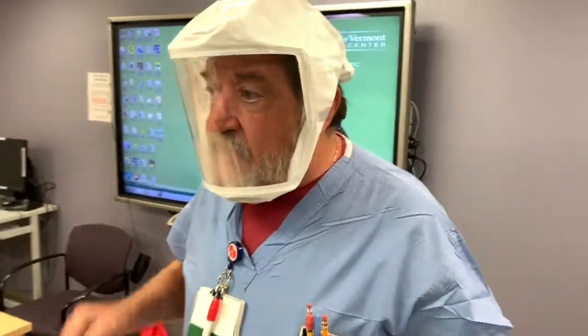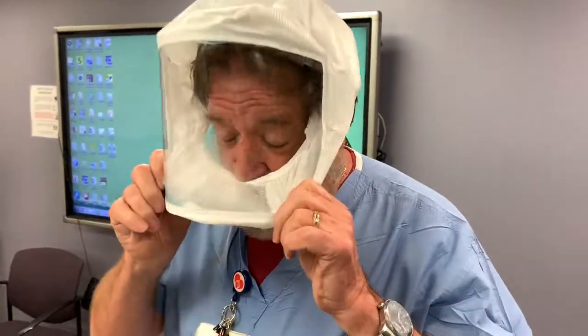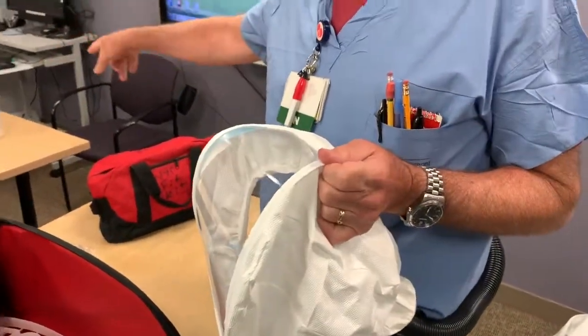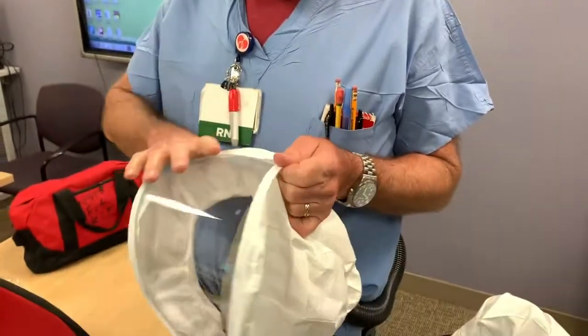For doffing, what I do is take it off first and then turn it off, because that'll keep blowing anything away that might contaminate. As soon as you've taken them off, you need to clean the inside with the Oxivir wipe. I also take the opportunity to clean the outside with the Oxivir wipe — you can basically clean the whole thing. It's easier to clean the outside sometimes while it's still on your head.